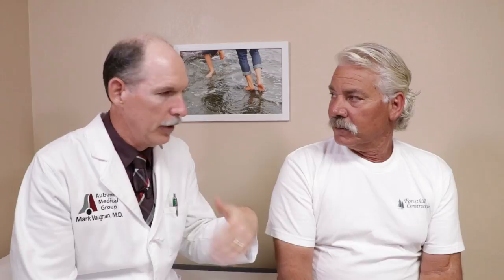He's the one who said we had to have a biopsy in order to treat you, and then he said any remaining basal cell — the way to get rid of it is real simple. You use an instrument called a curette and you scrape on it fairly firm. Everything that's supposed to come off does, because the curette really only takes off cancerous tissue, not healthy tissue. Then you cauterize it, then you do it again — three passes in succession. This is the instrument; it's called a dermal curette. It's not super sharp, so it won't cut into normal tissue, but it does scrape away the dead tissue.